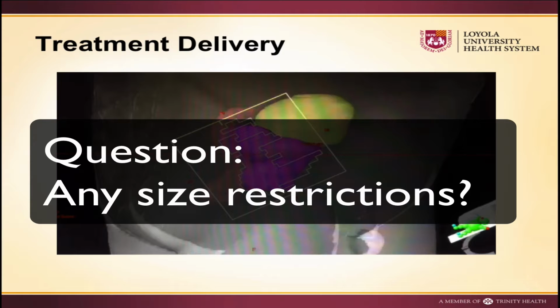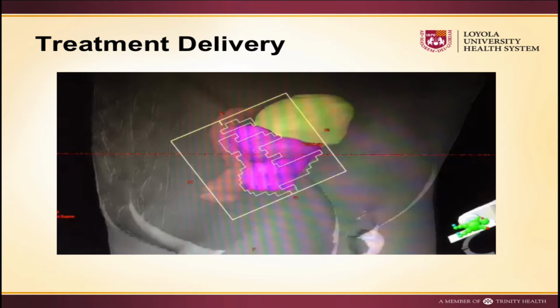Yes? Can you do any size prostate? Any size. Yeah. Really large. Yep. No issues with that at all. There are some machines that are kind of customized for what's called radiosurgery, like pinpoint treatment of brain mets. We had an old one. The picture I showed just replaced that machine in our clinic a week ago, where the field was 10 by 10 centimeters. But even then, if you were to treat a prostate, that's plenty big.